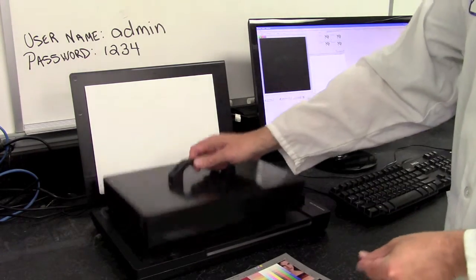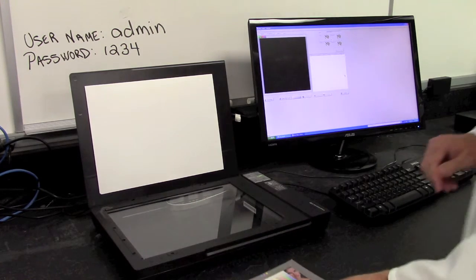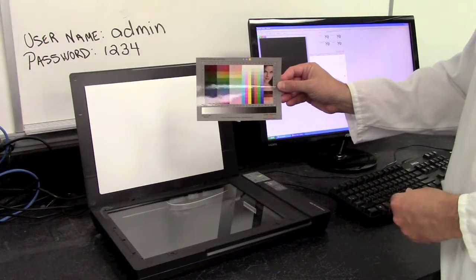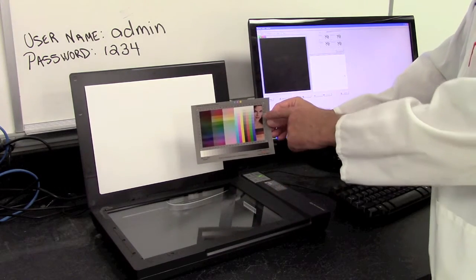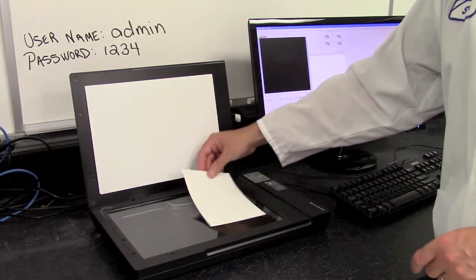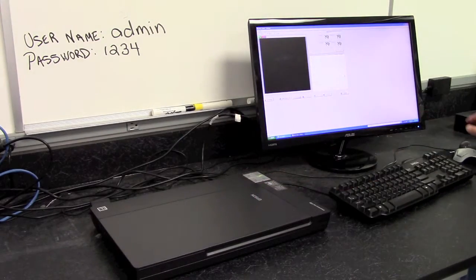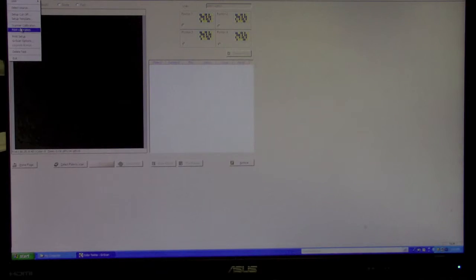So what we'll need to do is take the cover and the grid off of the scanner, and taking the color calibration card, you want to hold it and put it face down on the side of the scanner. So take the card with the woman's face towards the back and down right in the middle of the scanner face. Can you see that? Mm-hmm. Okay. Close the scanner lid, and on the computer we're going to go to your file option and then go to scanner calibration and then hit the start button.